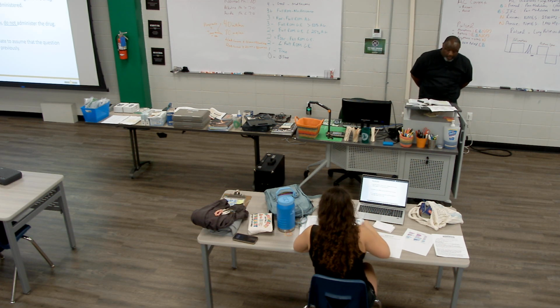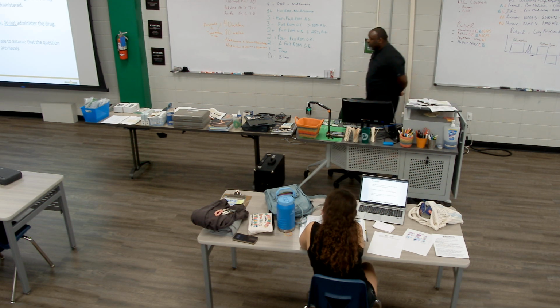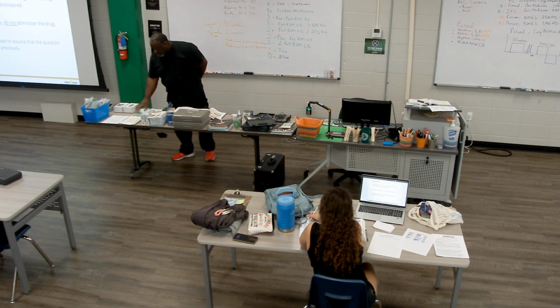So first, determine the treatment area. The electrode should be large enough to cover it, but not so small that current density is exceeded, meaning you want the electrodes to match the size of the area you're working on. Second, the clinician should saturate the delivery electrode with the drug solution. That will depend on where you're working and how the drug gets there.